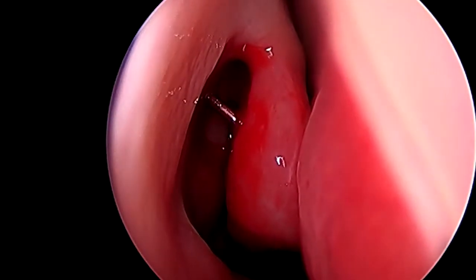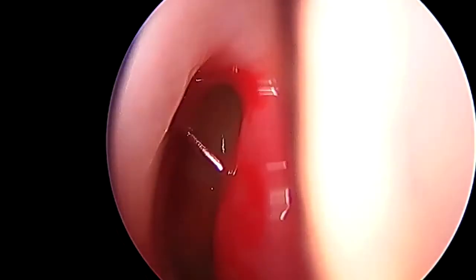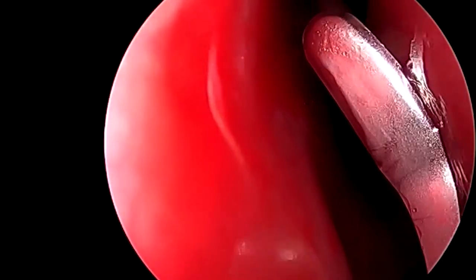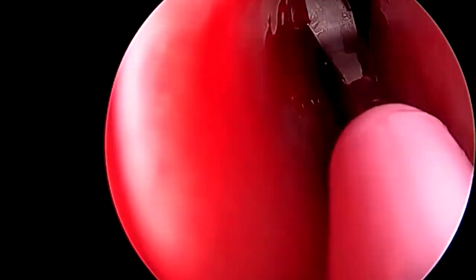Hello, this is Dr. Allison Watson and this is a case of a revision dacrocystorhinostomy through an endoscopic approach.